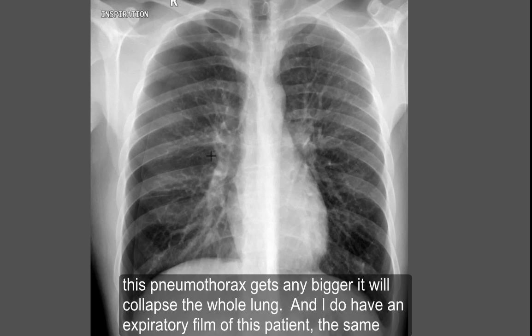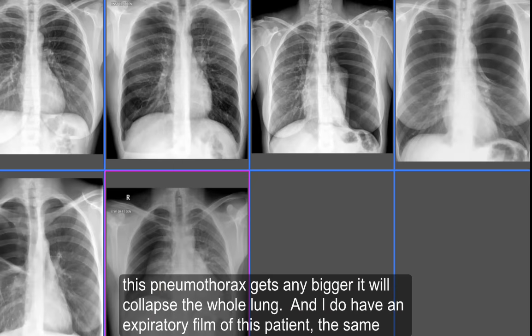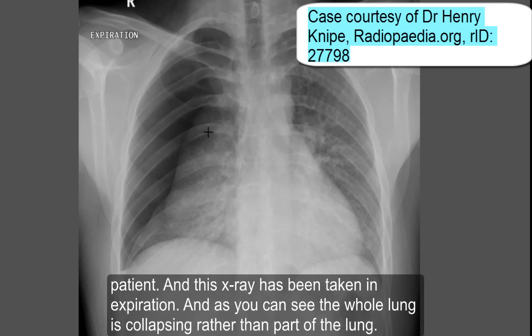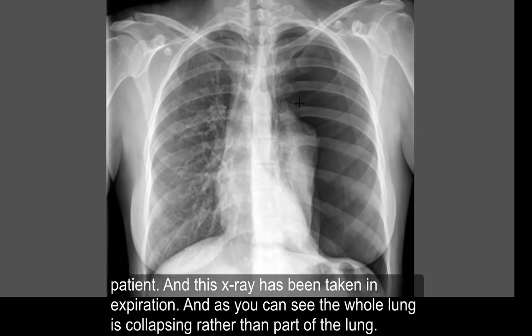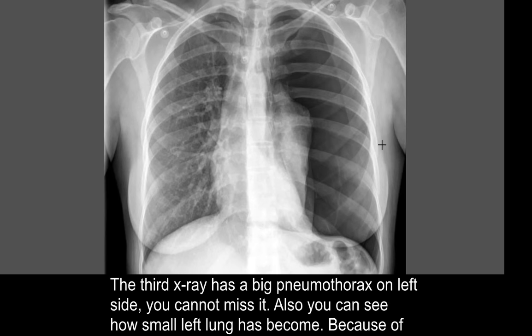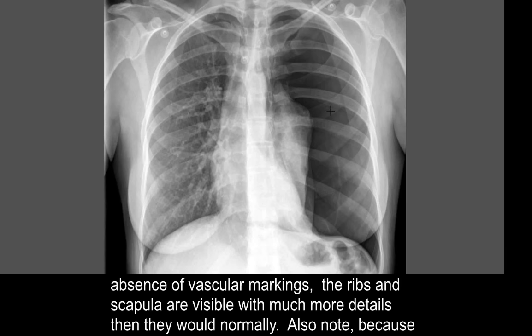If this pneumothorax gets any bigger, it will collapse the whole lung. I have an expiratory film of this same patient, and in this X-ray taken in expiration you can see the whole lung is collapsing rather than just part of it. The third X-ray has a big pneumothorax on the left side. You cannot miss it — you can also see how small the left lung has become. Because of the absence of vascular markings, the ribs and scapula are visible with much more detail than they would normally be.